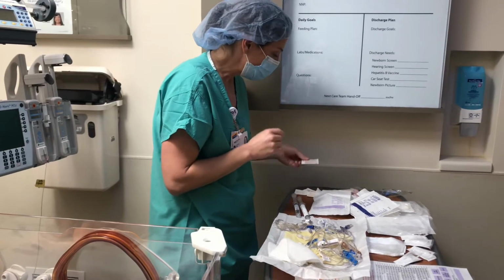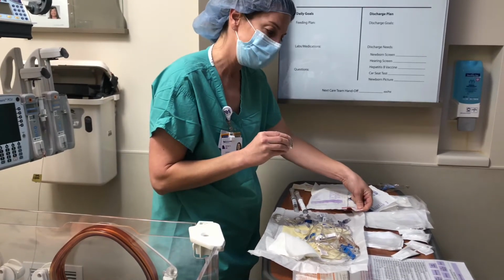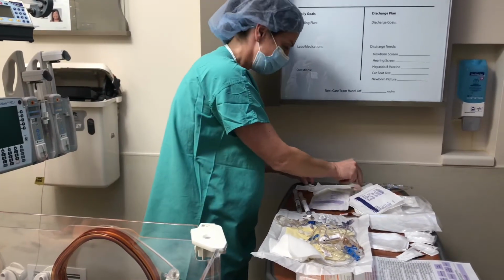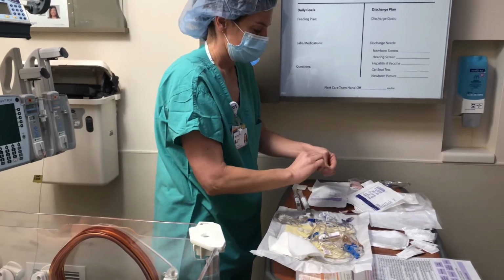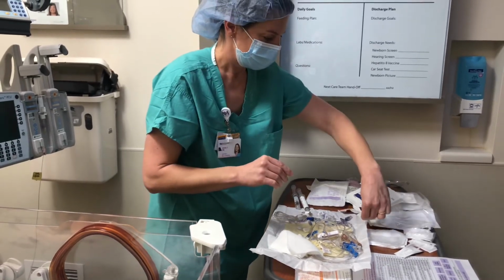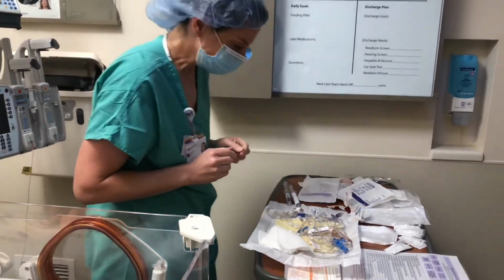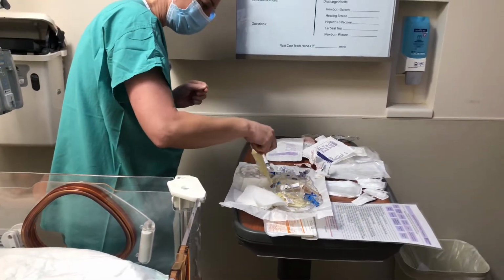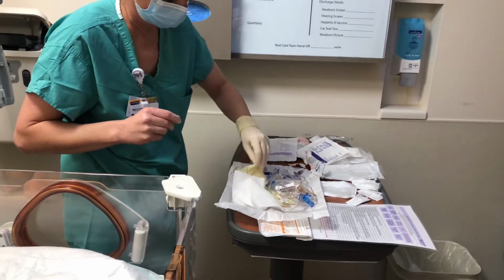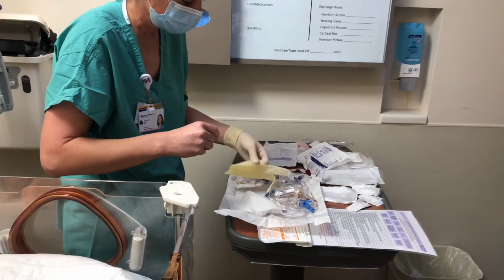Next, we're going to open our alcohol and betadine, and you can open up a couple of them. I only needed to use one of each in this procedure. And then I'm going to place these on the perimeter of the field as well. Okay. And then next I'm going to don my sterile gloves. And then that other pair of sterile gloves, again, is for use later, that I'm going to keep on the side.